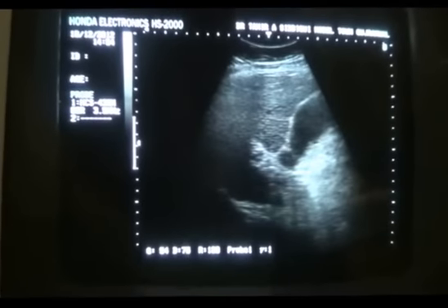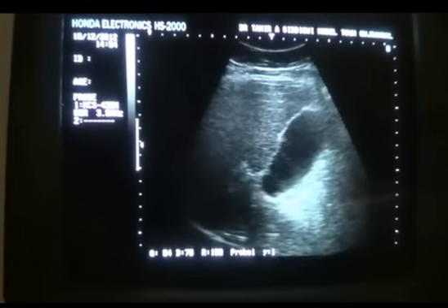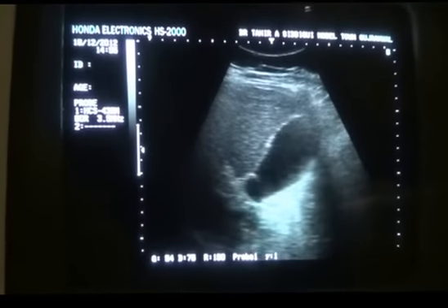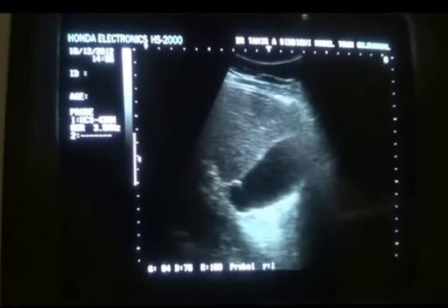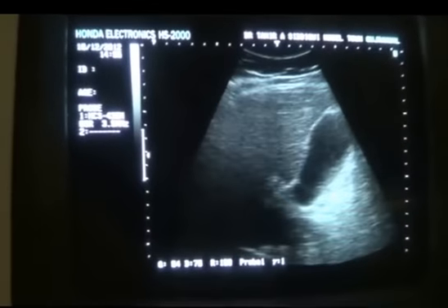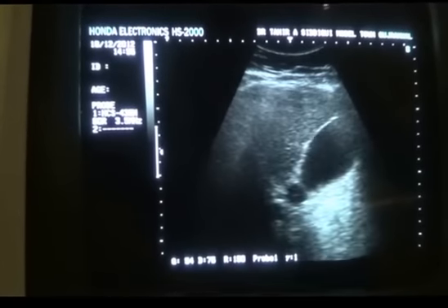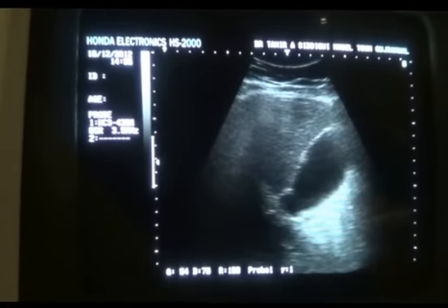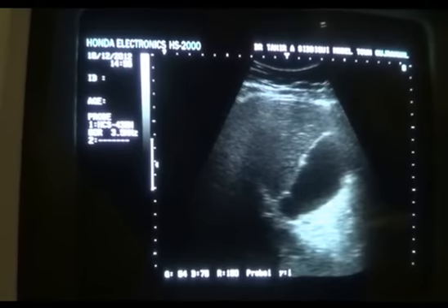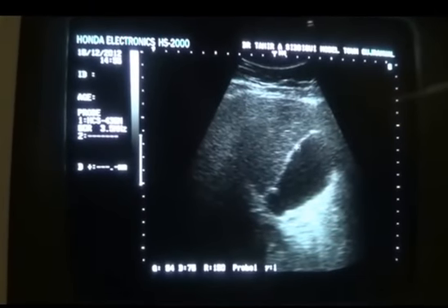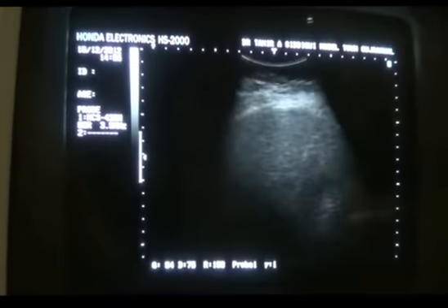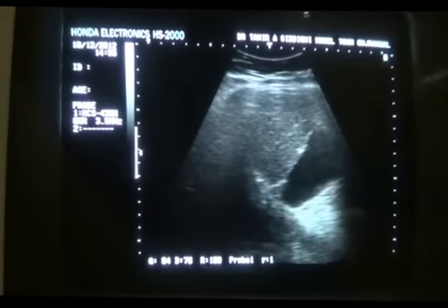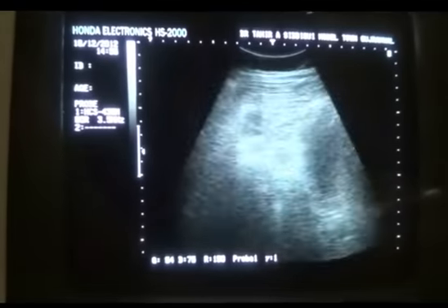Now see the gallbladder wall. The gallbladder wall will show a very characteristic appearance. You will see the shagginess of the wall. This is the right lobe of the liver.